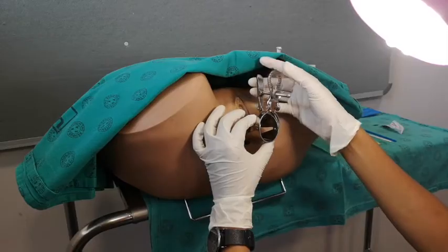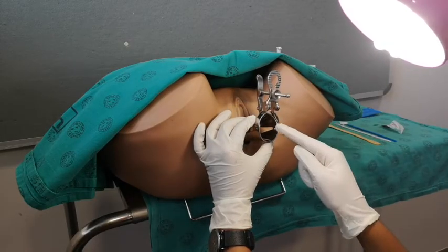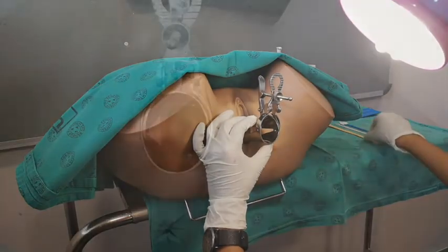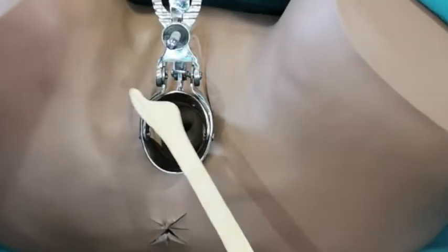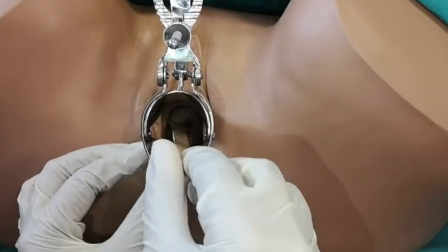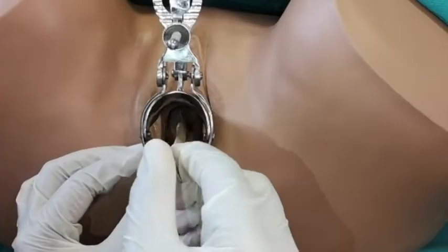Inspect the cervix for any abnormalities and look at the os. Insert your Ayre spatula and turn it 360 degrees once.